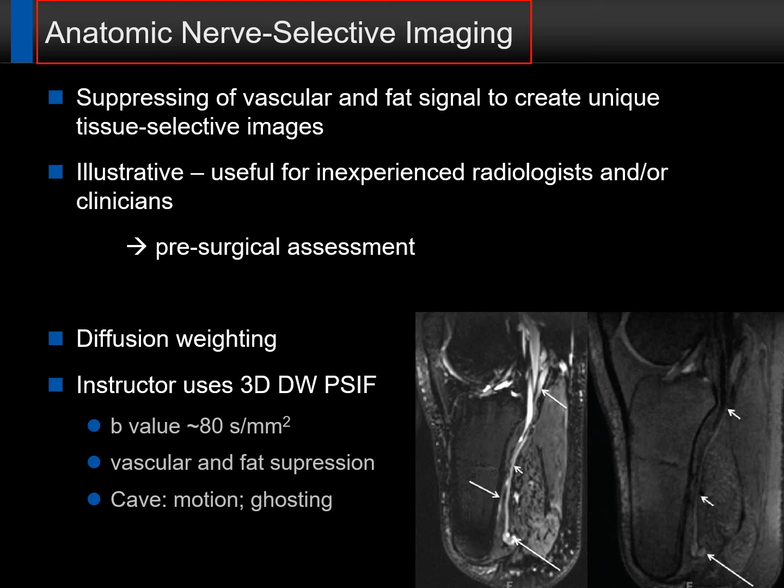In this case, there was a diffusion pulse used to suppress the vascular signal around, so that you can really work out and see the nerve only, and that is an ideal situation. Depending on the different manufacturers, there are different techniques available, but they can help, and you can avoid misinterpretations by nearby vessels or other bright structures.